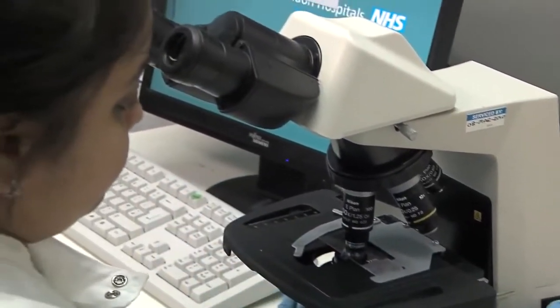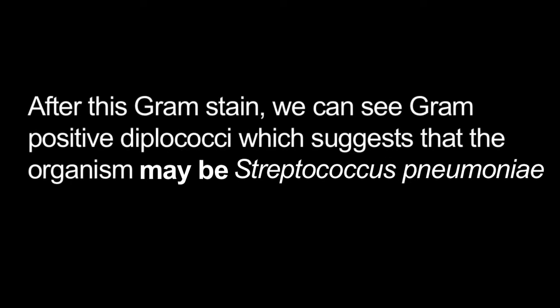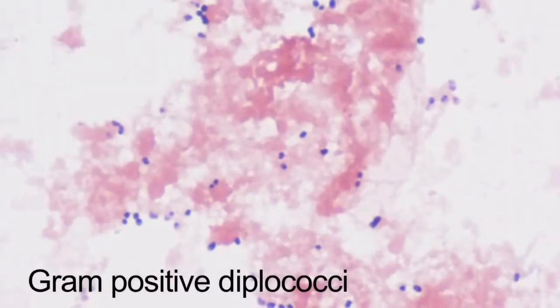The most common organisms found in blood cultures include Staphylococcus aureus, Escherichia coli and other coliform bacteria, Streptococcus pneumoniae, Enterococcus species, Pseudomonas aeruginosa, and Candida albicans. This particular positive blood culture shows gram-positive cocci in pairs, diplococci. On the basis of this gram stain, the biomedical scientist can also perform a range of direct identification tests on the blood to aid with the presumptive day 1 diagnosis.